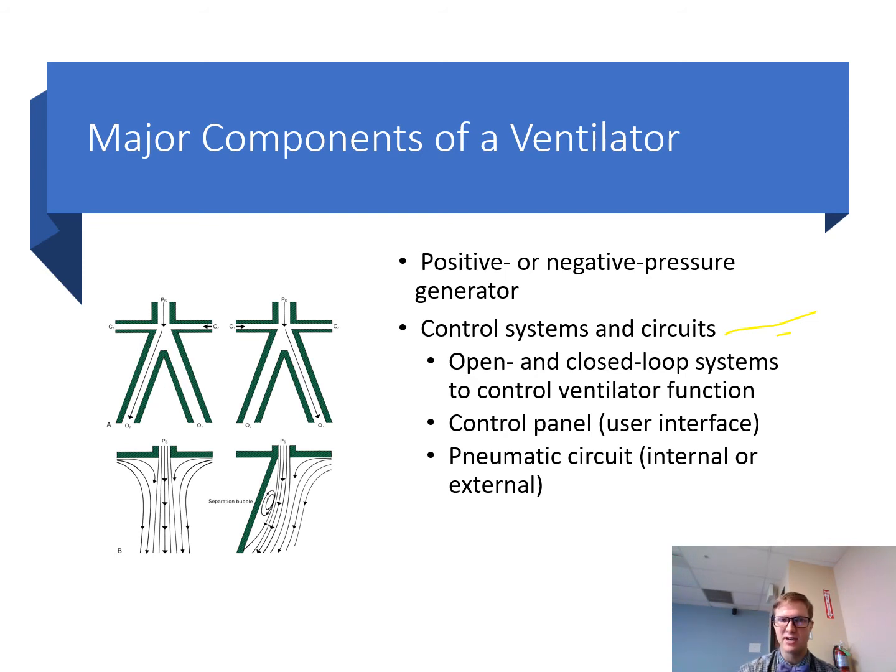So let's say a ventilator is programmed to monitor your non-invasive saturation, your SpO2. Right? So if your saturation drops below 90 for longer than 30 seconds, then the ventilator in a closed loop system can be programmed to activate an audible alarm that can't be silenced, and then red flashing visuals. It's going to throw a whole light show at you. The ventilator could also be programmed to increase the oxygen percentage to 100% until the alarms have been answered or deactivated by the user, right?